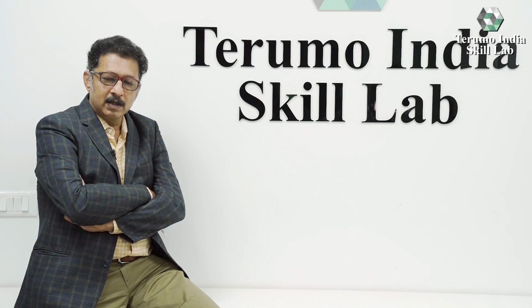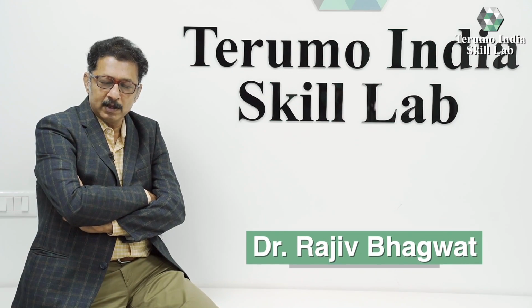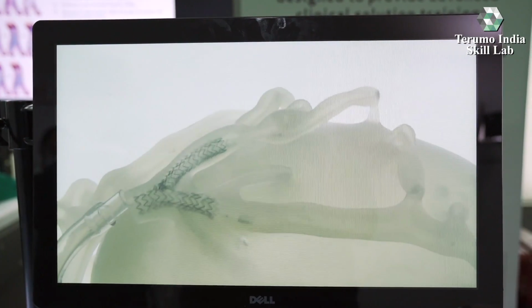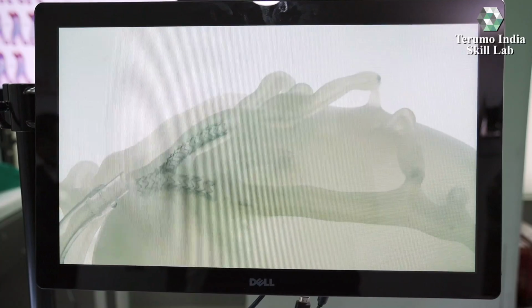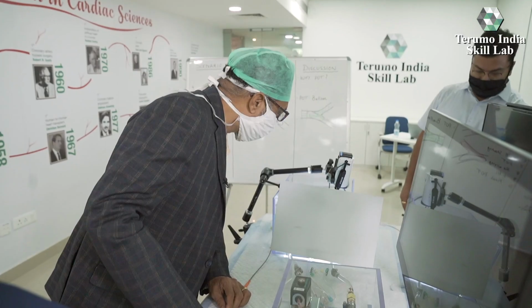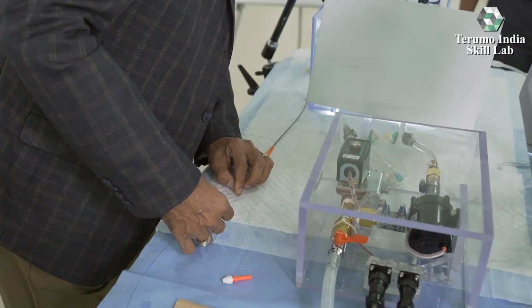So today we are at Terumo Skill Lab, and Terumo has just received a beating heart model, which is possibly the second or third in the world. And the beating heart model will help us demonstrate how difficult or how easy angioplasty is in a beating heart. We will hopefully be able to record the proceedings and show how the procedure goes.